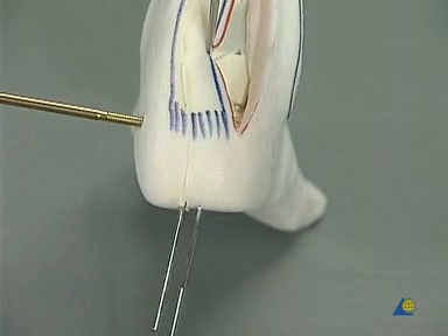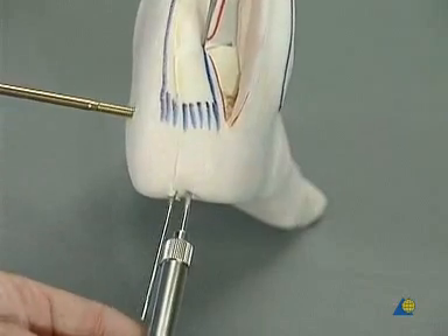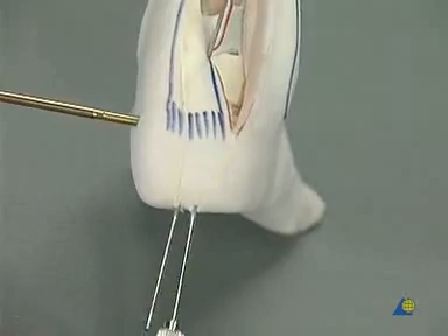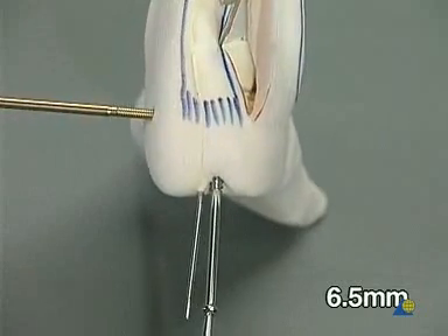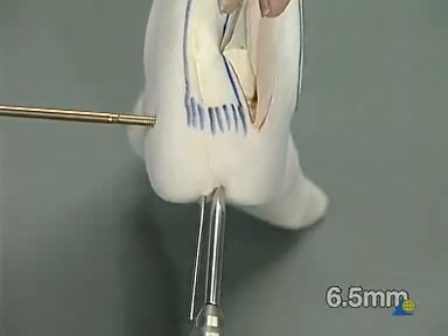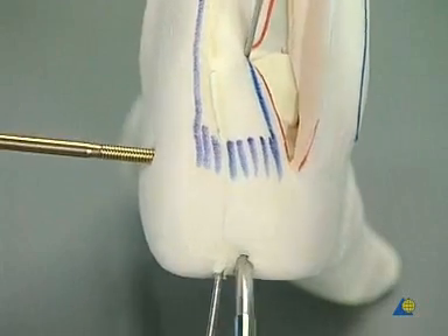The depth is measured. A 6.5 mm cancellous bone screw with a short thread is inserted using the air drive. The final tightening is done by hand.